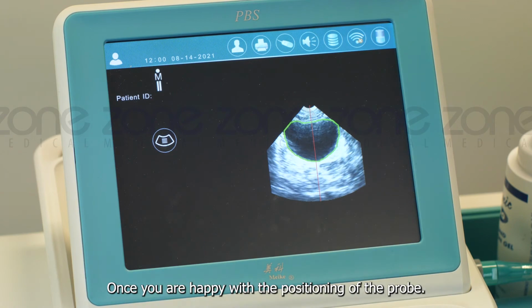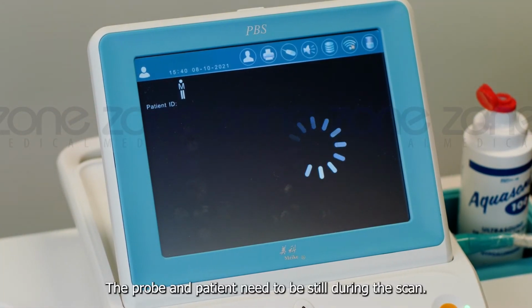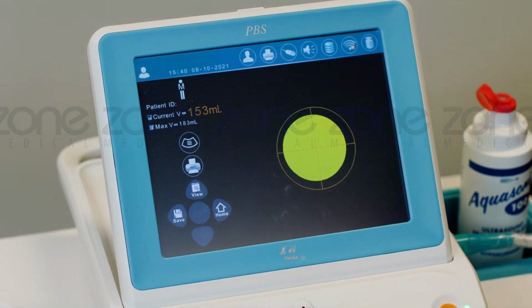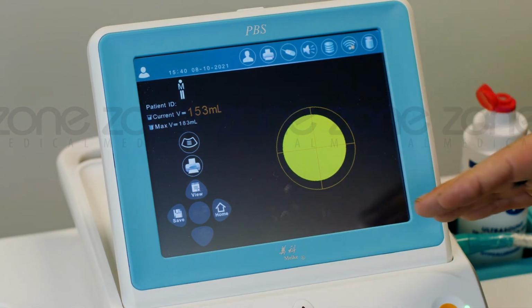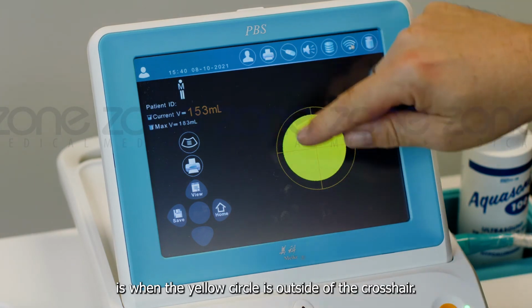Once you are happy with the positioning of the probe, press the scan button. The probe and patient need to be still during the scan. The crosshair indicates how accurate your scan was. The only time this should be of concern is when the yellow circle is outside of the crosshair.